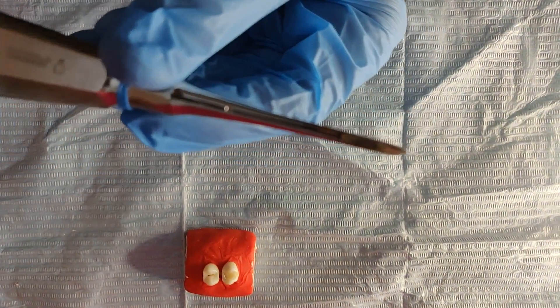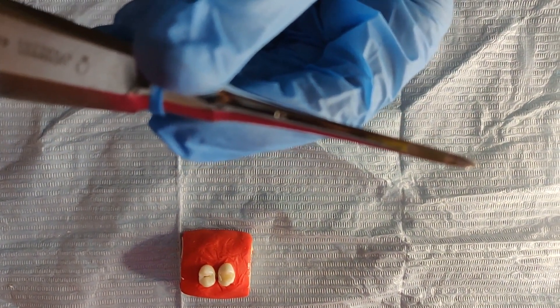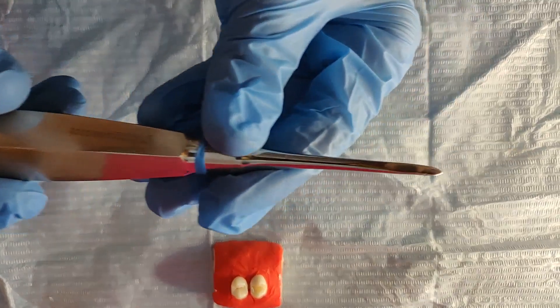The blade of the straight elevator is concave on its working side and it's placed toward the tooth to be elevated.